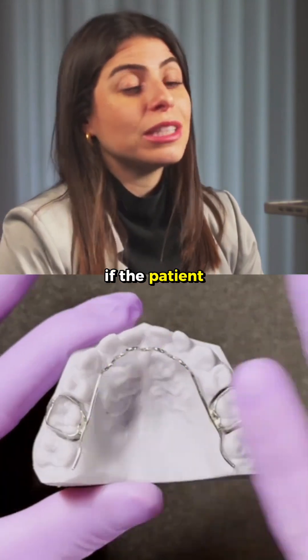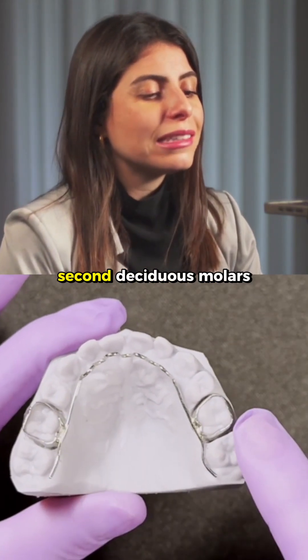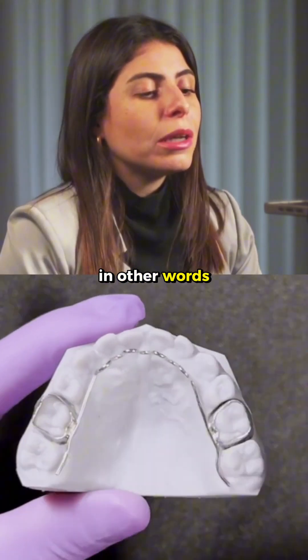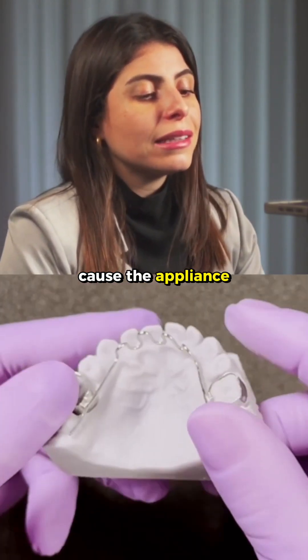I always recommend that if the patient is at the beginning of mixed dentition, place the loop band on the second deciduous molars and extend this framework to the first permanent molars. That way, you'll have less tipping. In other words, the tongue will put pressure on the area of the trap, but it won't cause the appliance to become unstable.